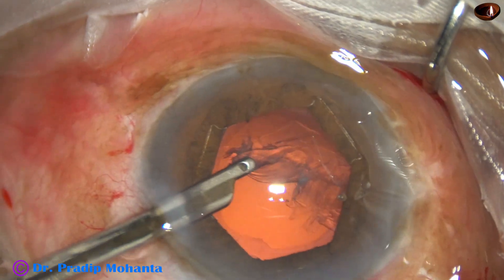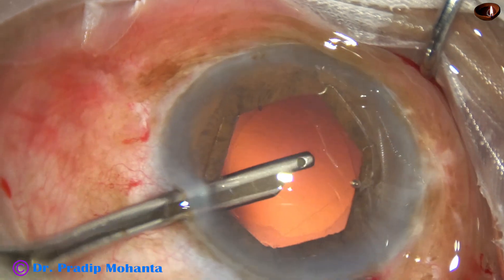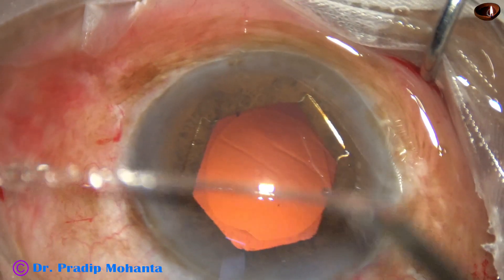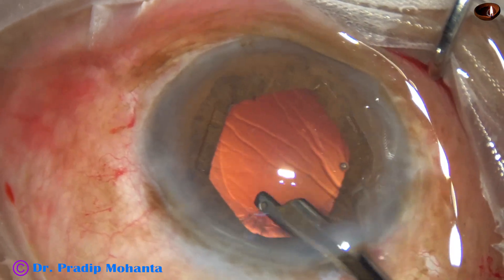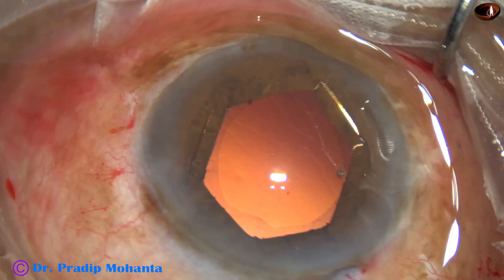There is some more cortex at 7 o'clock — it has come out. Now we have removed the cortex nicely. Some more cortex is there. So much cortex was there — it appeared that there was nothing. It appeared that there was nothing there.